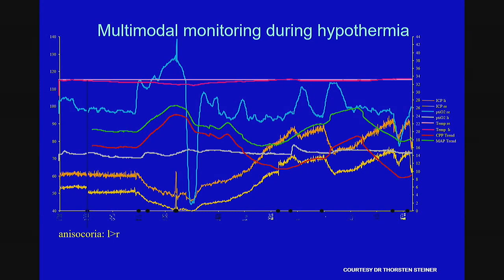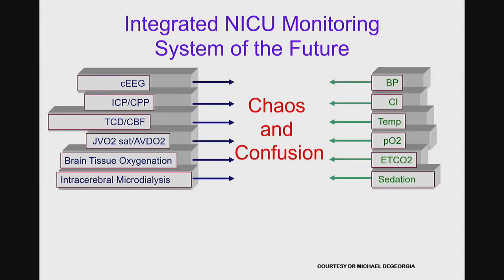So we add modalities. And if we image the data using conventional time series data here, it can start to get pretty complicated because we're adding more and more and more lines of information. And then we're trying to figure out, well, when that happens and this happens and that squiggle goes up and that squiggle goes down, what's going on? And so we realized a few things. First of all, our ICU rooms have not up until now been optimally designed from an engineering point of view to connect, plug and play all the different monitors, devices, machines, ventilators, cooling devices, et cetera.